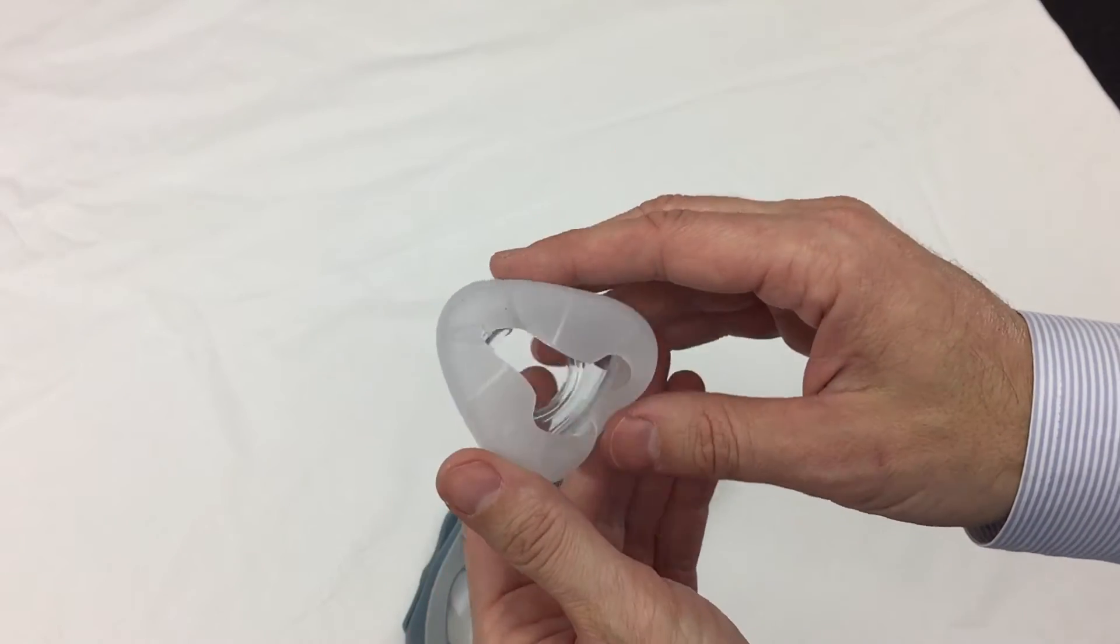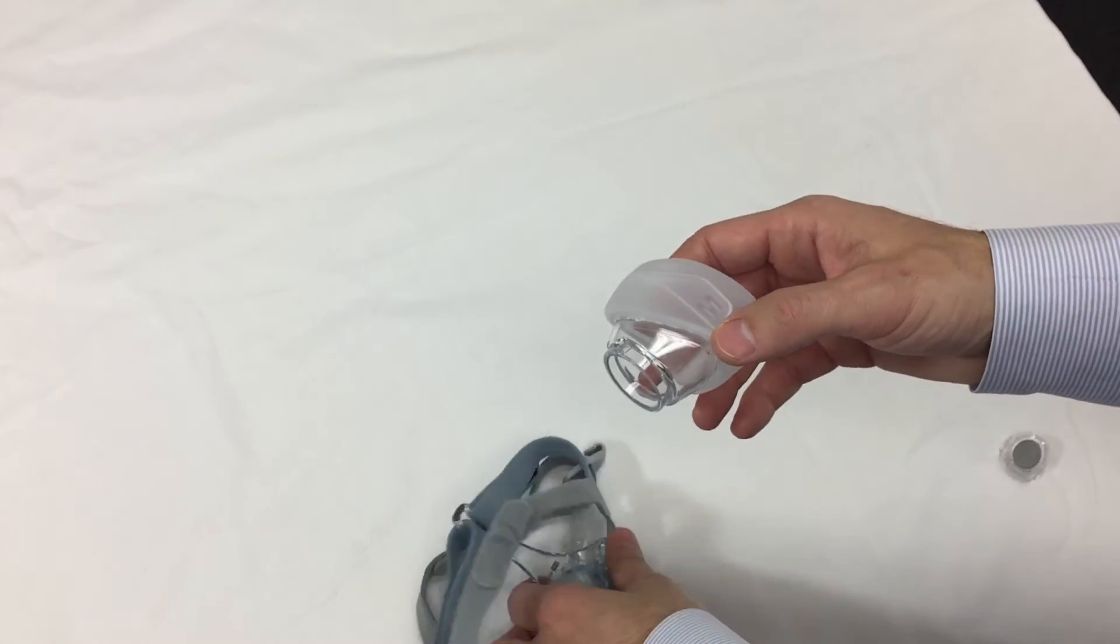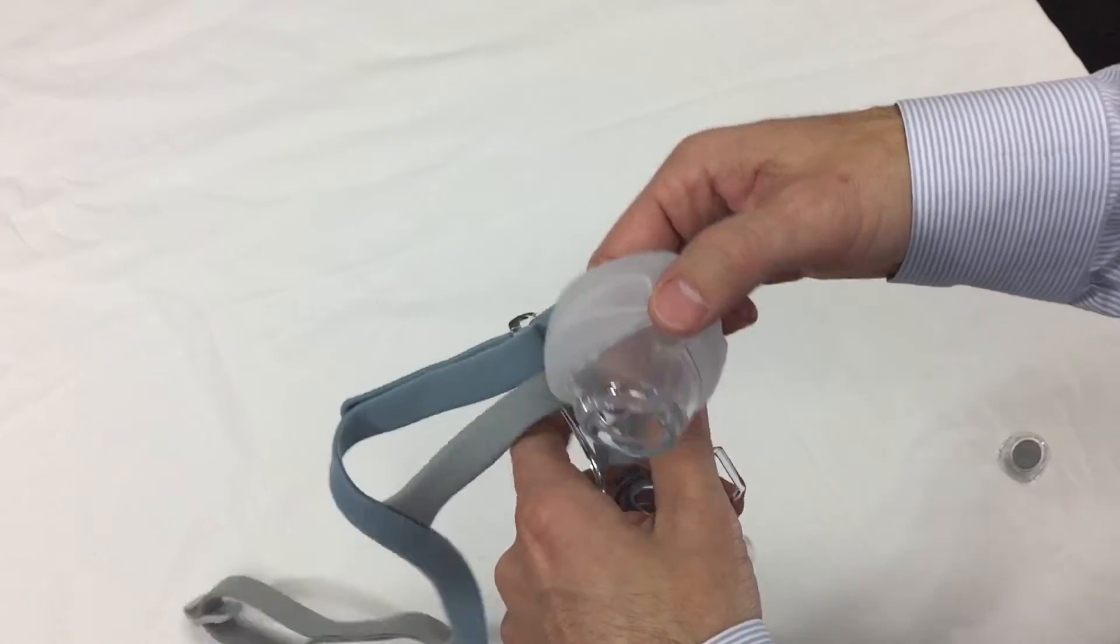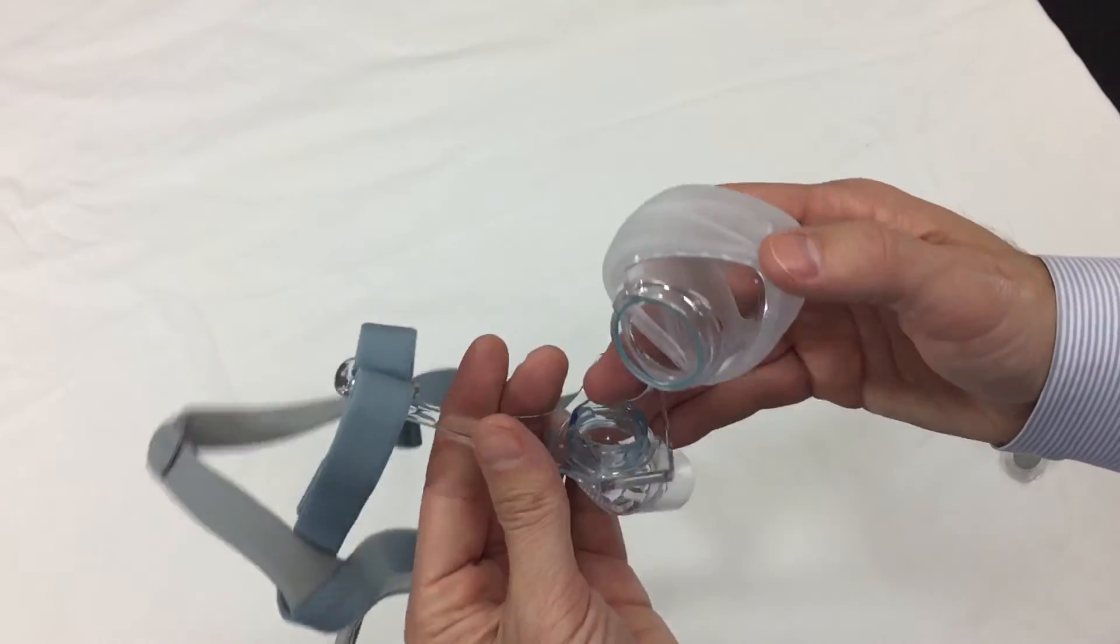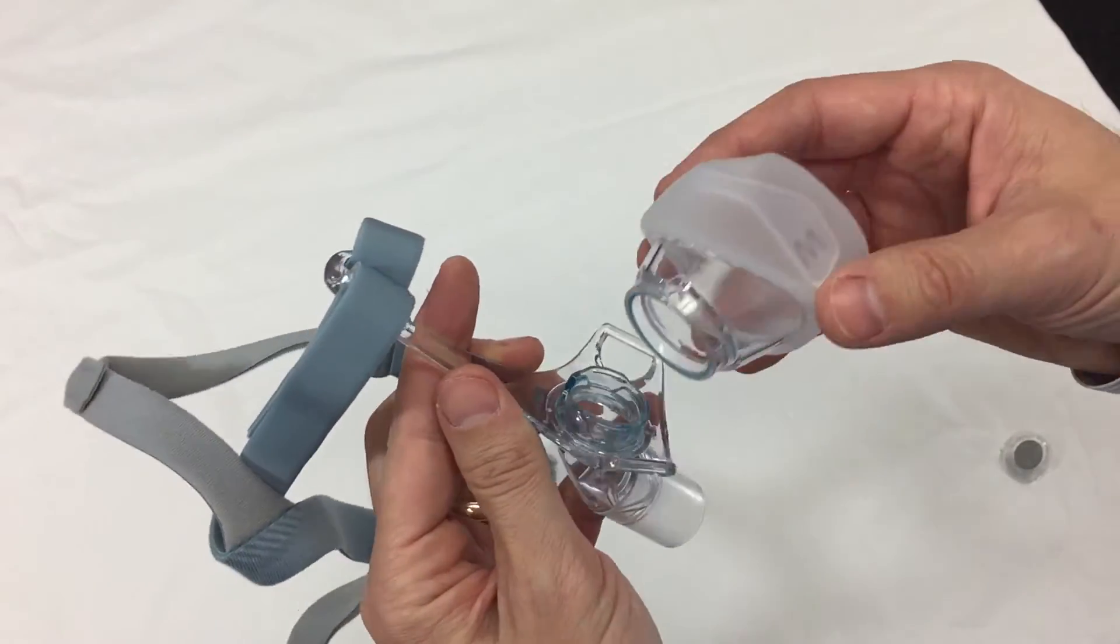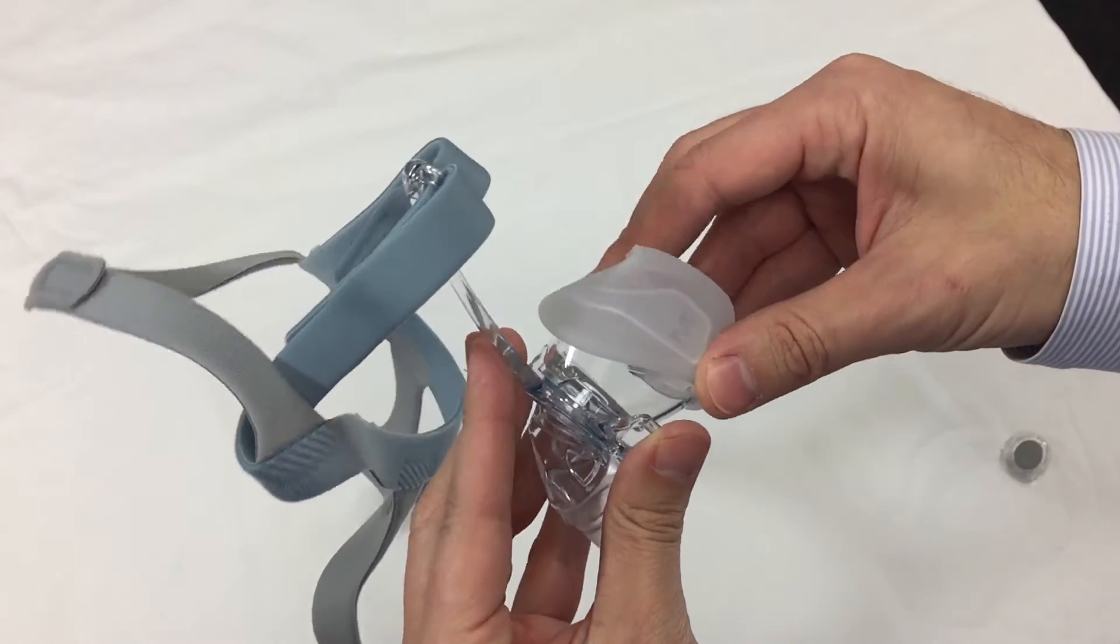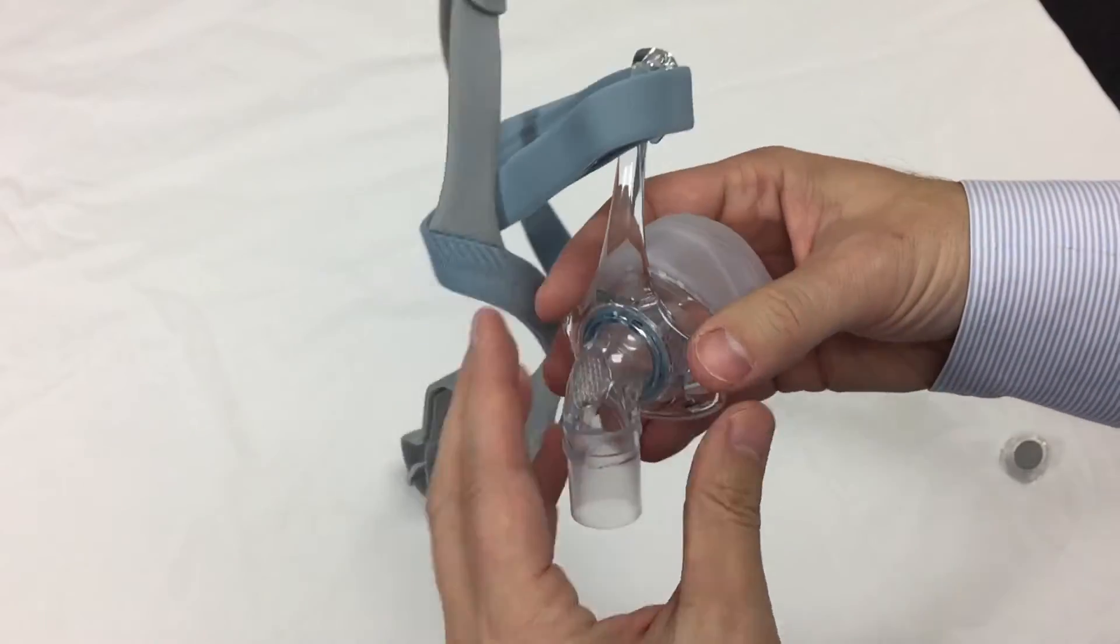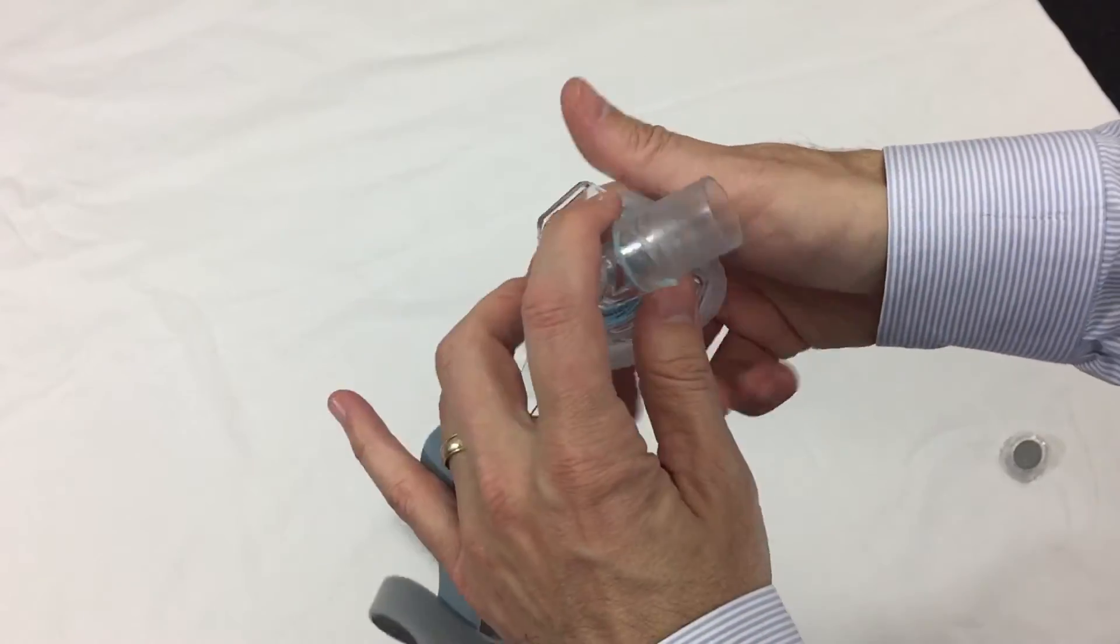It's almost like a crumple zone built into that to allow for some imperfections in your face. Or if you have a mustache, it will seal really well. It's color coded as you can see. There's a slight blue tint on the frame and also the cushion so you'll know where to connect it.